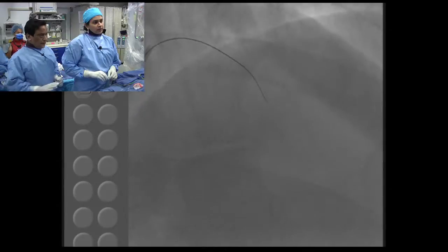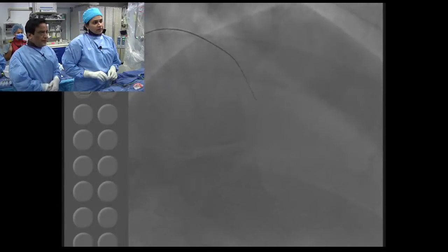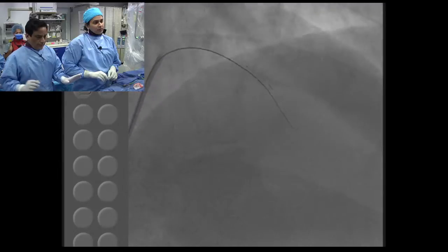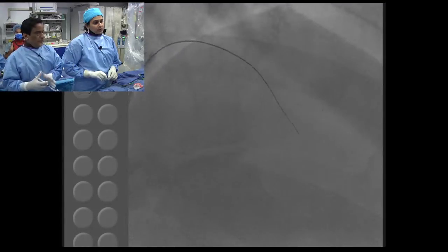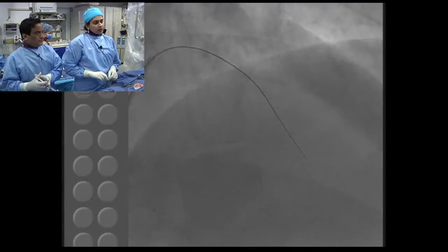Yeah, this looks better. No. This is a different one, yeah? No, better. It's not going to the LAD. Yeah, no, but see, this has definitely a better, different direction. It's going to the same. Let's take a picture. Some PVC. Yeah, okay. Let's take a cine. This is definitely a different direction. Okay, some dye. Probably not.